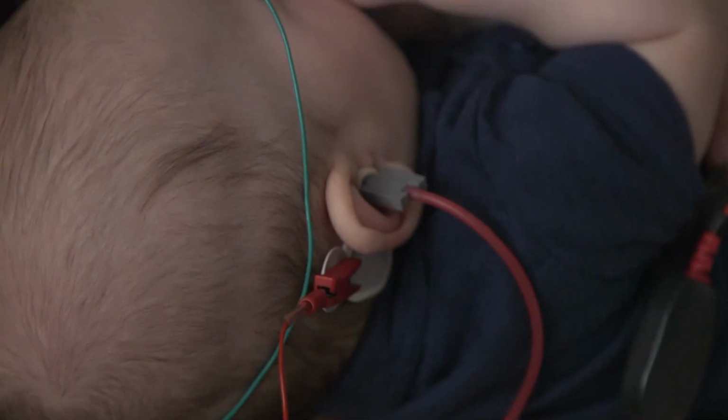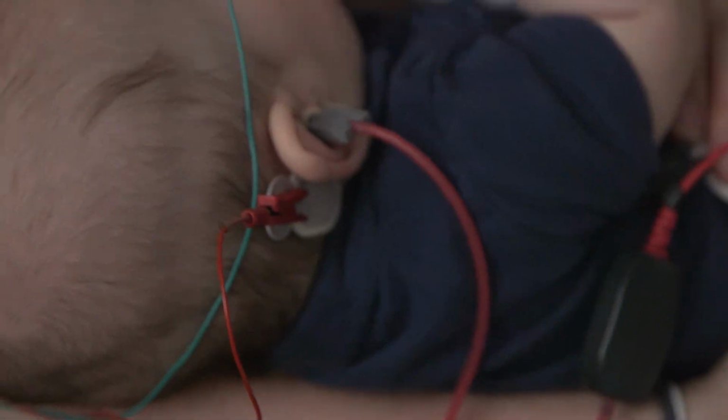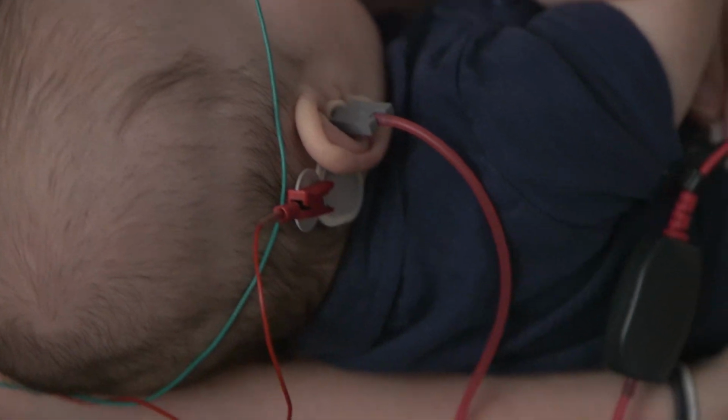Both newborn hearing screening tests are completely painless. They're very safe to do on newborns. They are relatively reliable, but they are a screening test. If the baby doesn't pass the newborn screening, regardless of which method is used, we will want to do a more complete test.